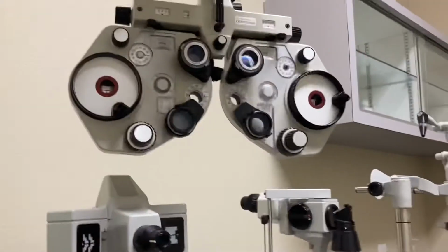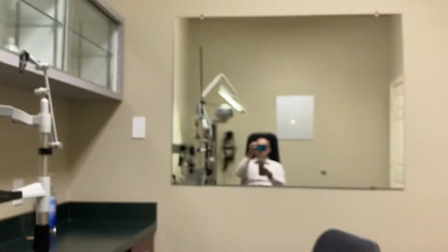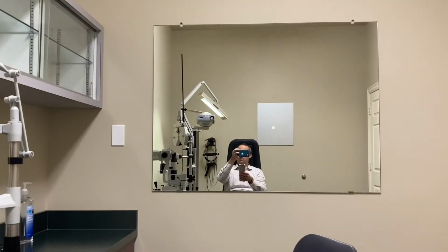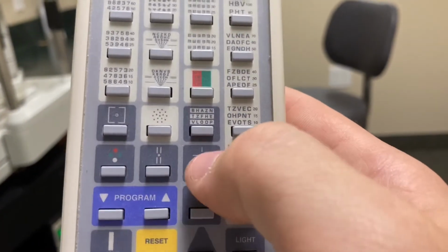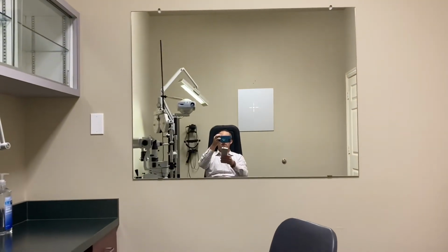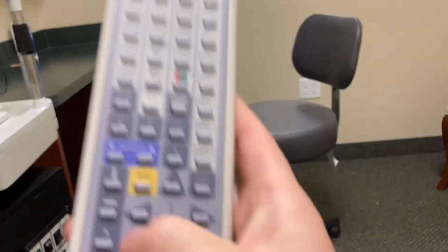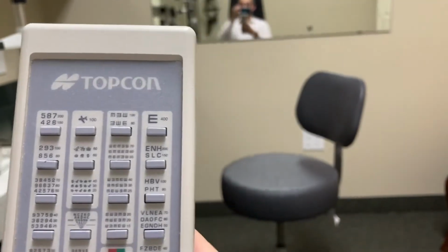It also has the red-green test, which you can do, and it has the red-green on the Projector, and it has the Worth 4 Dot, which we hardly ever use, but if you wanted to, you could do that without having to buy a Worth 4 Dot, because you got the red-green on the Projector, and you got the button on here. It gives you the cross with the dot, and it gives you a single dot, which I like to use for cover test. And then it's got, right here, yeah, it lets you red-green over anything.